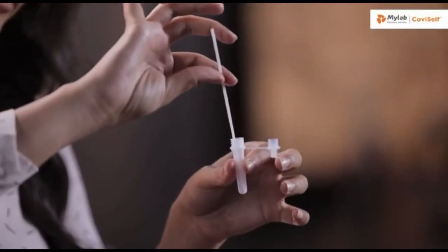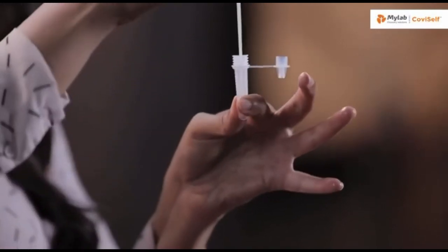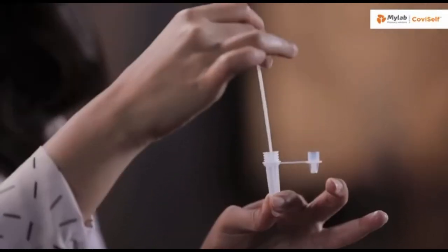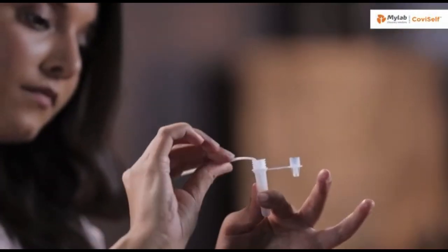Dip the nasal swab sample in the pre-filled extraction tube. Pinch the tube at the bottom and swirl the nasal swab well. Make sure the swab is immersed in the liquid. Find the break point and break the swab.